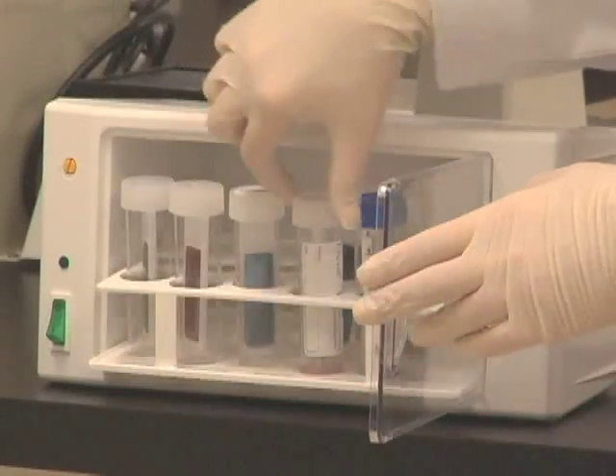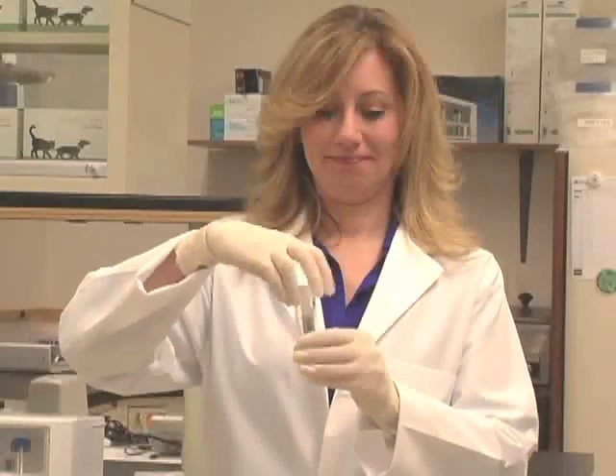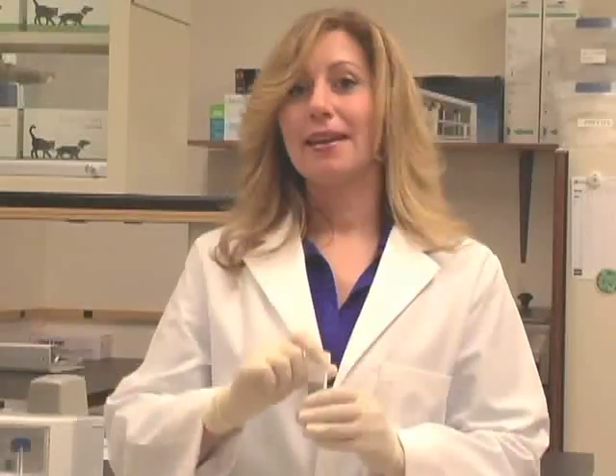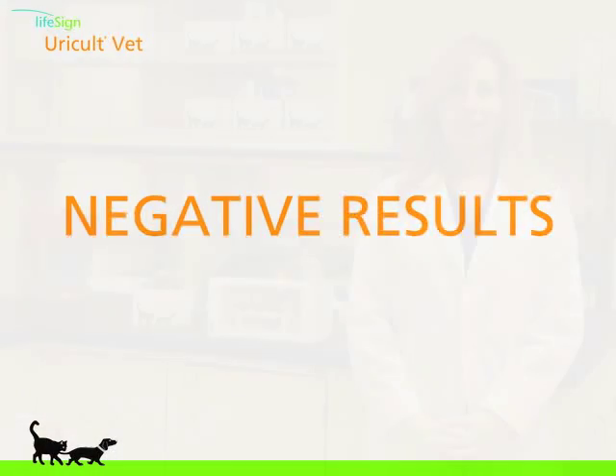After the 16 to 24 hour incubation period, you are ready to read the results. Remove the Uricult VET paddle from the incubator and from its plastic vial, and inspect both sides of the media for bacterial growth. It is best to hold the paddle under a light when you're looking for bacterial growth and for colony characteristics. When there is no sign of bacteria growth and no color change on either side of the media, the Uricult VET paddle may be placed back into the incubator for an additional 24 hours to allow for the possibility of any slow growing bacteria to appear.